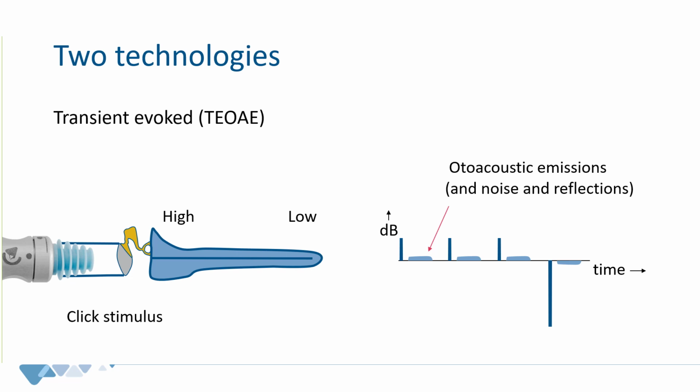Now, when you subtract this last recording, you do not only subtract reflections, you actually also subtract a little bit of the OAE. But the OAE of a 3 times as big stimulus is not 3 times as big. It is maybe the same or slightly bigger, depending a little bit on the intensities that you're working with. So this OAE that you subtract doesn't cancel out the other 3. So the OAE that you end up with is basically a difference measurement and not an indication of the exact intensity of the OAE, but a leftover proving that there is OAE.